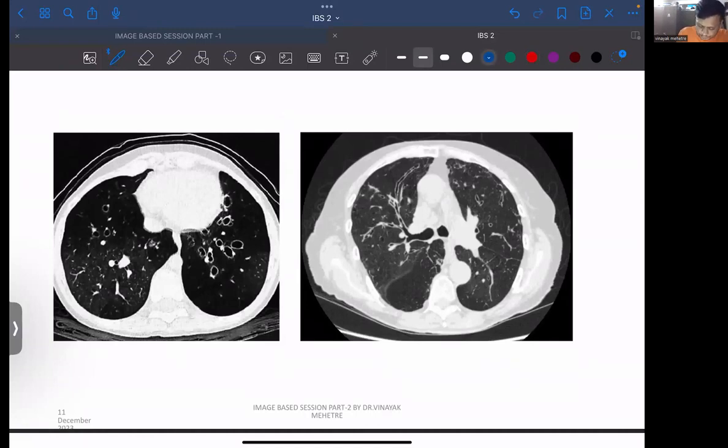If you are poor and you are not able to give a ring to your girlfriend or boyfriend, you can give this ring for sure, right? On X-ray, it is called signet ring appearance. It looks like this, signet ring appearance. Okay, and there is one more appearance.